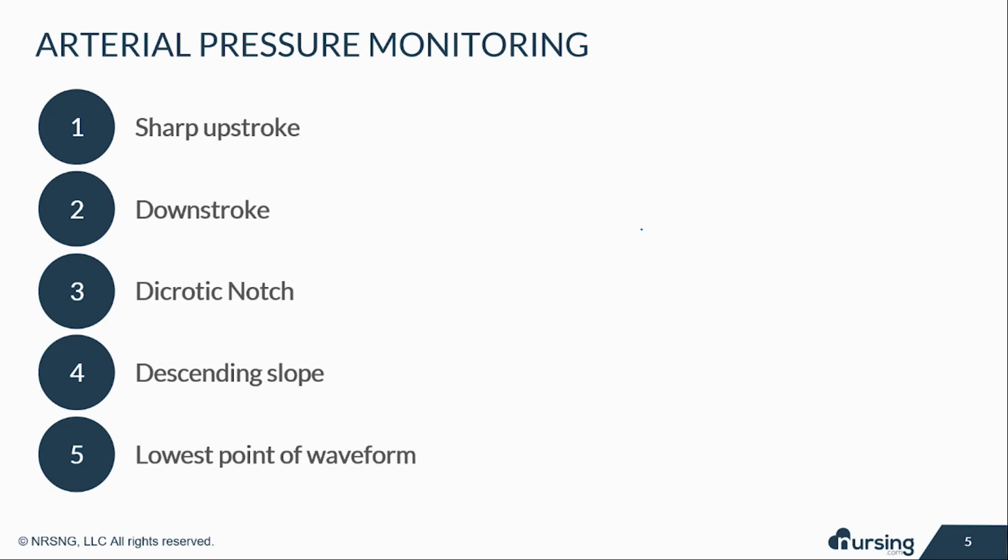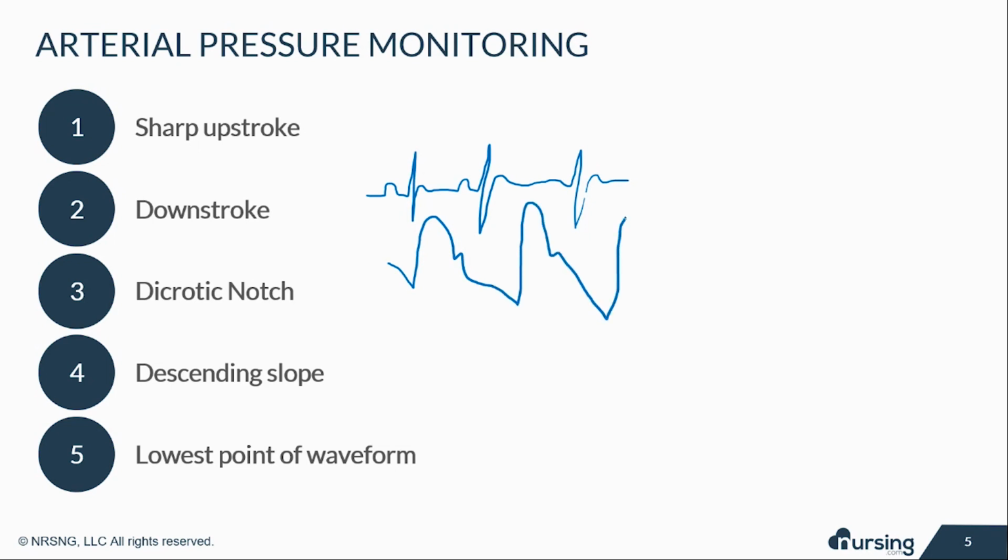I'm going to try to draw this to the best of my ability, so just stick with me a little bit. It corresponds with the cardiac cycle on an EKG. Okay, so if I have an EKG, the art line corresponds with the EKG. So again, please just go with me. The art line looks something like this. I'll explain it in one second.